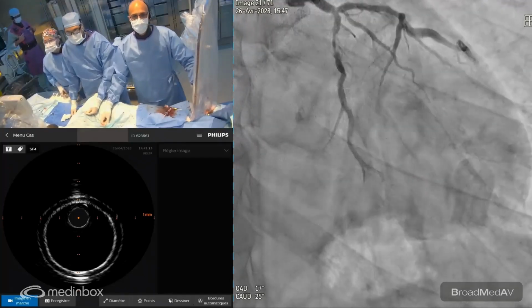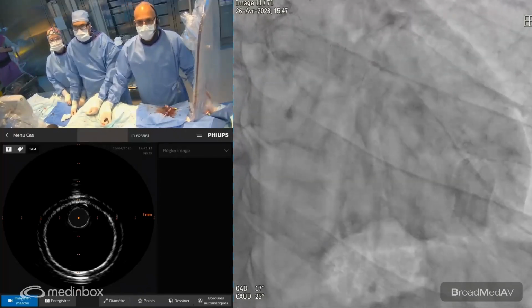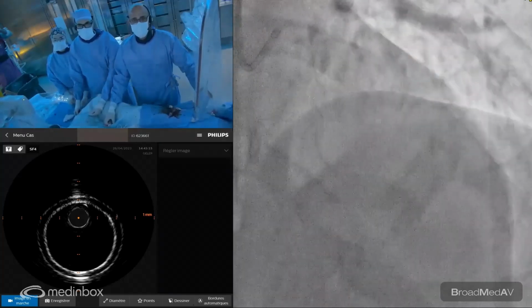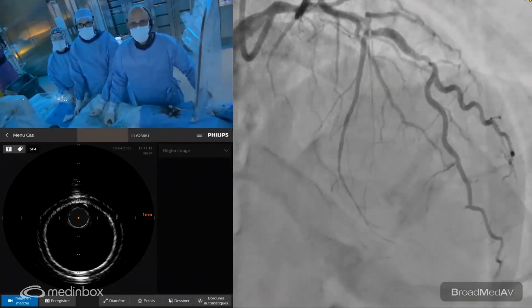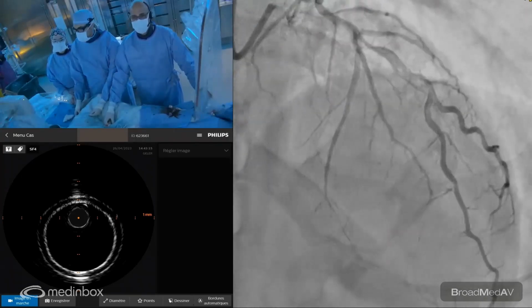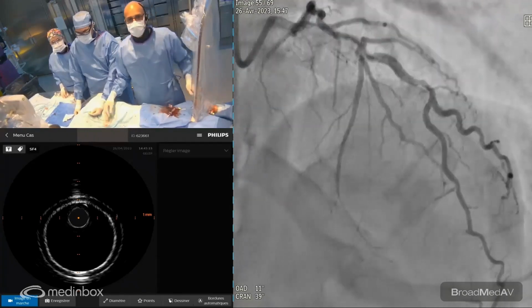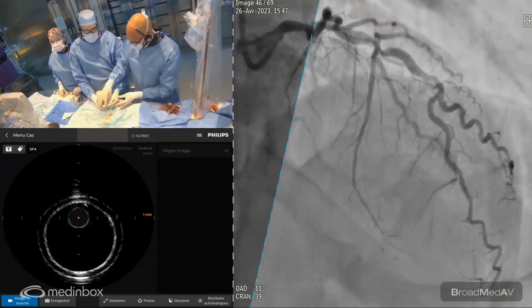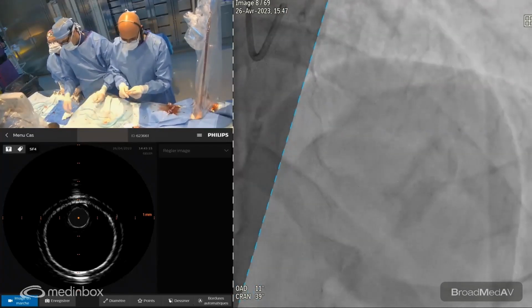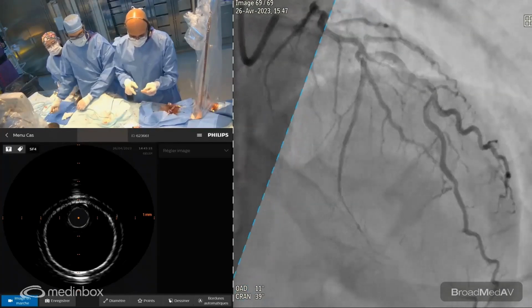For sure, the issue with atherectomy in this kind of case is that you need only one wire. And there's also the tortuosity in the LAD. So we'll bring down a workhorse and we'll perform imaging to see what's going on exactly in the LAD, left main, get the MLA of the distal left main.